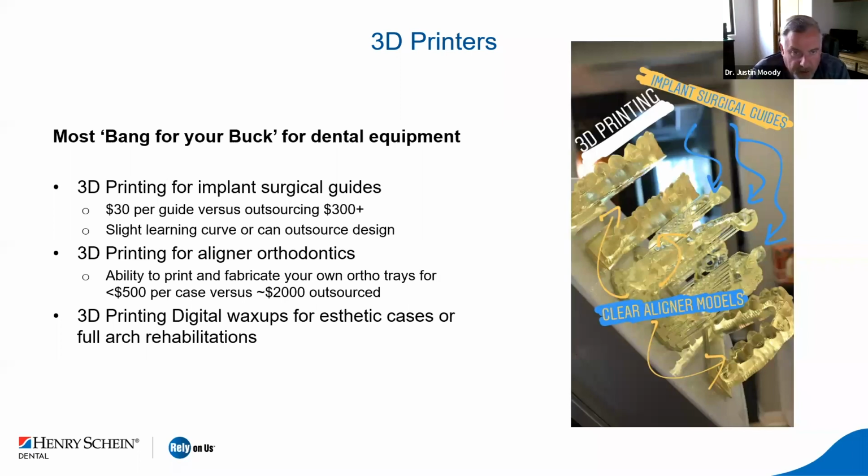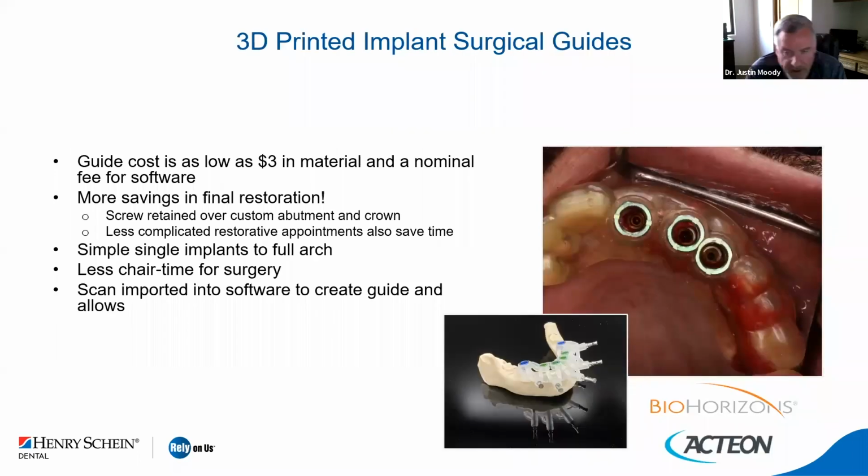When we talk about 3D printing, I already said that we have no choice but to talk about cone beam CT. And in our clinics, and down at New Horizon with Implant Pathway, currently we're using Acteon imaging cone beam CT, both the Trium and the Prime, to provide us with cone beam CT technology. And their new AIS software has built-in surgical guide creation.